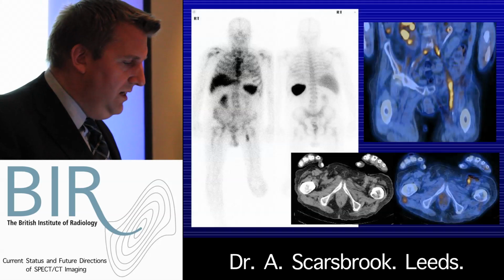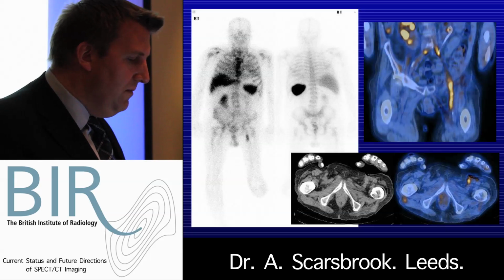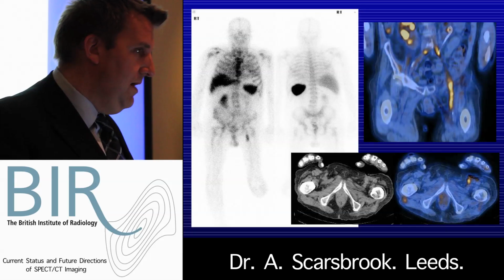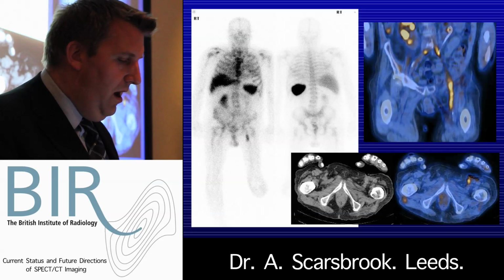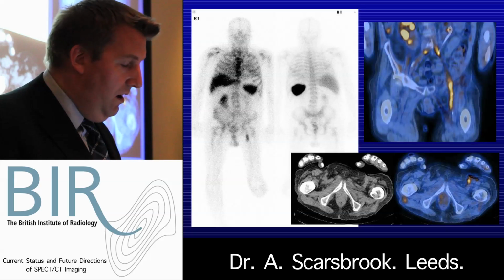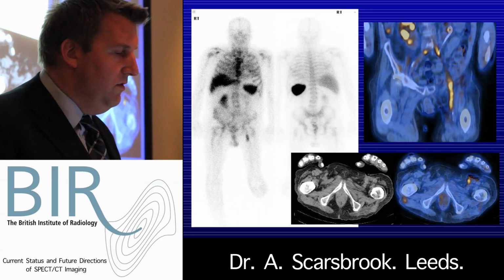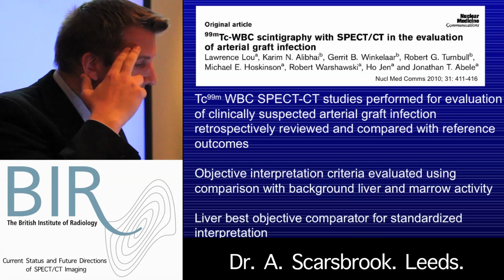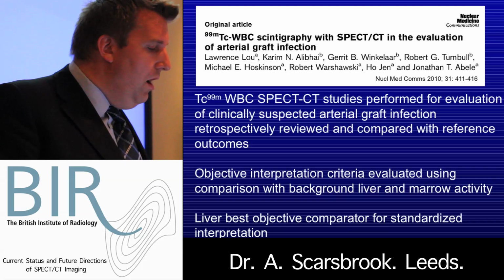Here's a more recent case where it was a patient that had an aorto to left femoral graft and had come in with an abscess in the groin, and there was considerable concern about graft infection. You can see on the hybrid imaging there's very extensive uptake related to that vascular graft, and this patient had to go for emergency surgery.